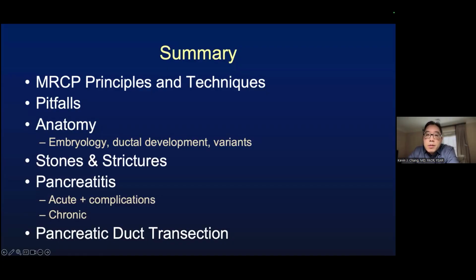The next question would be, how would you distinguish between focal necrotizing pancreatitis and hypoenhancing pancreatic adenocarcinoma? That's an excellent question. There can be overlap. We can't always differentiate focal pancreatitis from a pancreatic mass. That is definitely a known pitfall for imaging of the pancreas. But when I see a focal finding in the pancreas associated with upstream ductal dilatation, especially if there's a lack of the clinical findings that you typically see with focal pancreatitis, I'd be more suspicious for pancreatic adenocarcinoma in those cases.